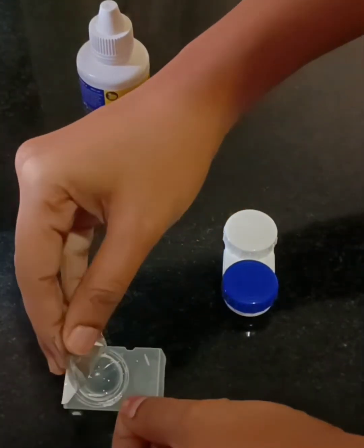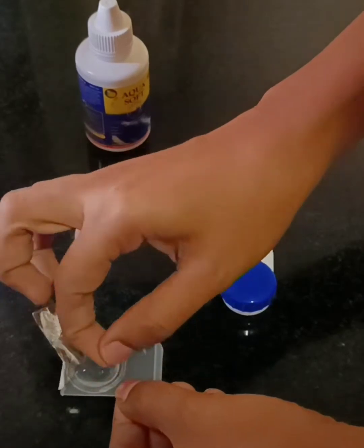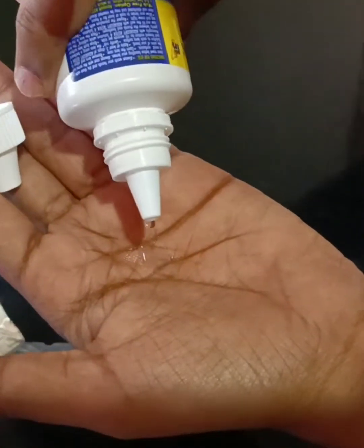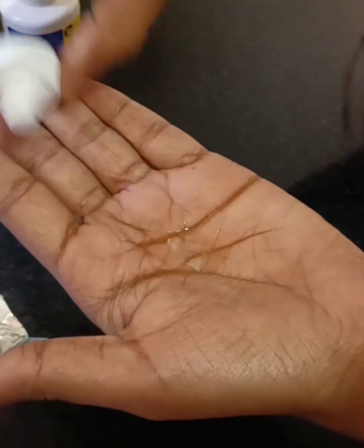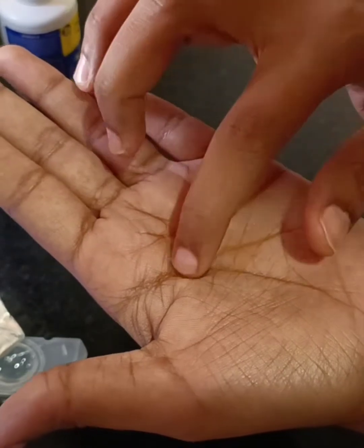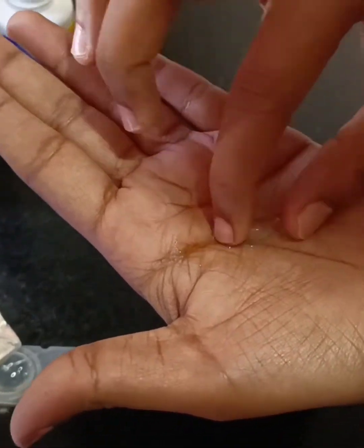After properly washing and drying your hands, you can take the contact lens, keep it on your palm, put the contact lens solution on it and then using your index finger, you are supposed to rub the contact lens in clockwise direction and in anticlockwise direction for about 10-15 seconds.